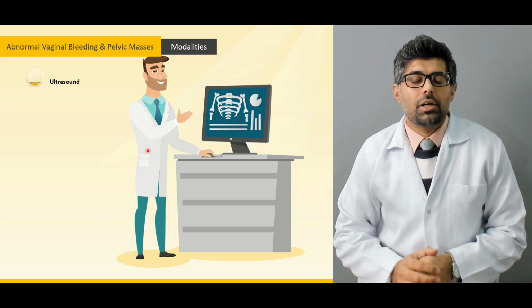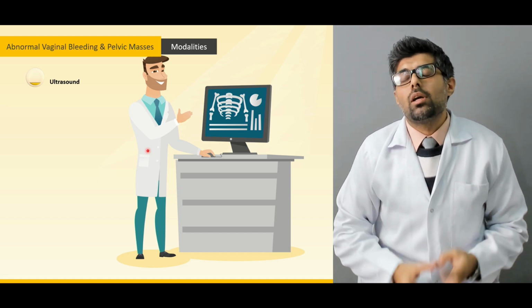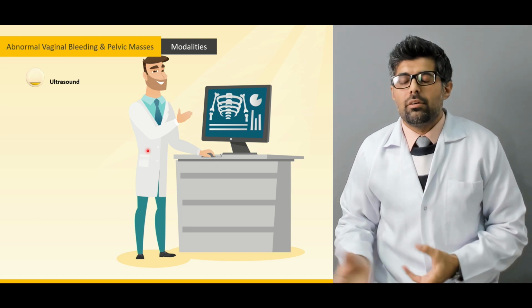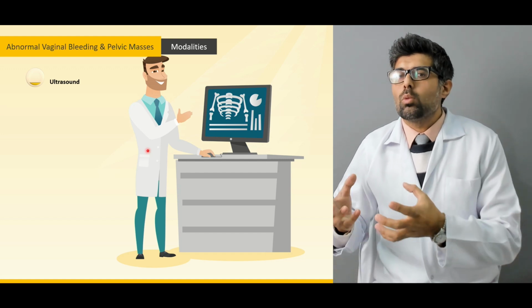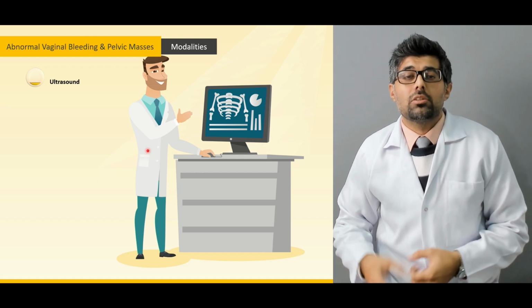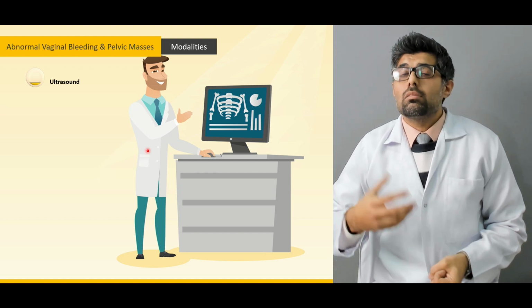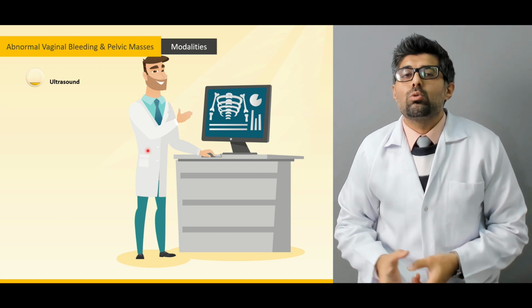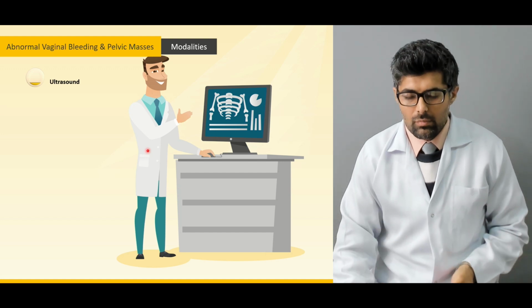These are the ultrasound, because in female anatomy, ultrasound is the gold standard, the modality of choice, because one, it is quick, fast, reliable. Second, it is portable. Another feature is that it can be used in hard to reach places.